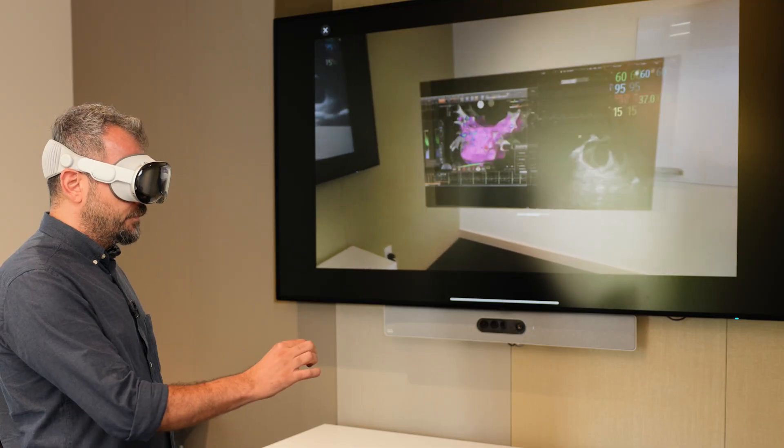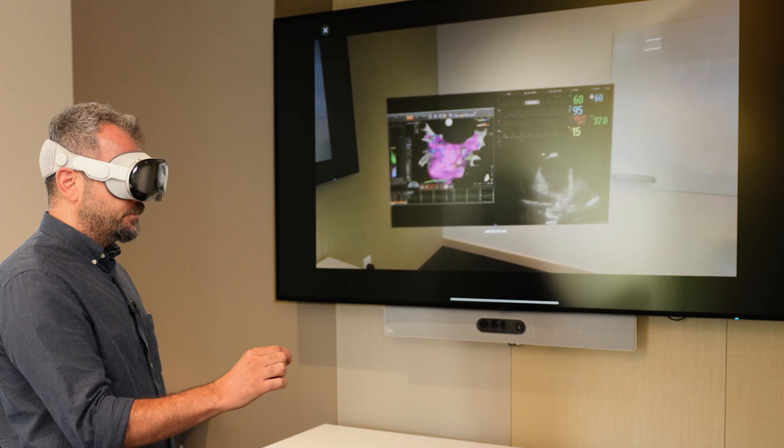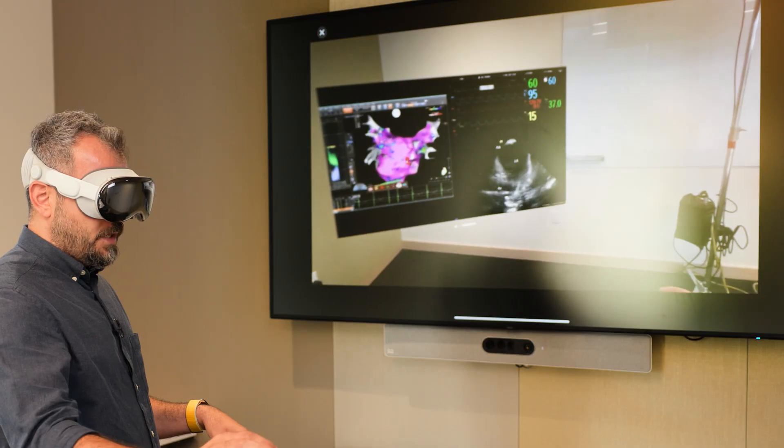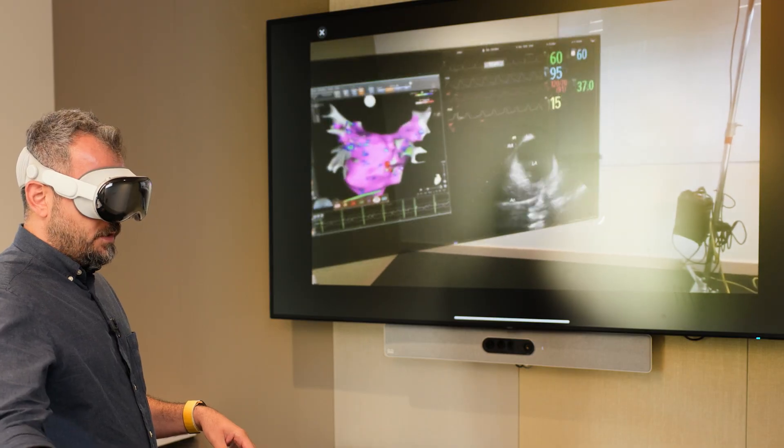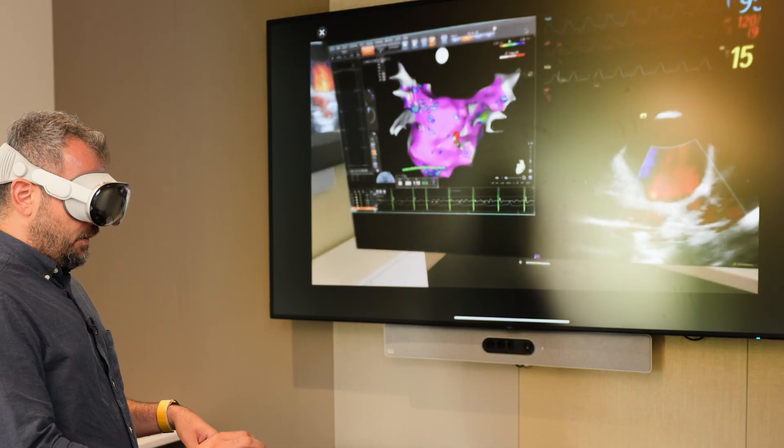With hand motions, I can take the monitor and move it to anywhere in the room that I would like. I can scale the information to any size I want — take a screen showing real-time images of someone's heart and make it miniature or as large as an iMac Studio. That's a really unique and novel way to interact with and consume that data during procedures.